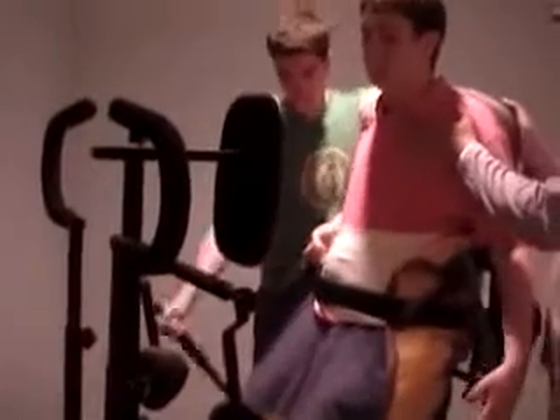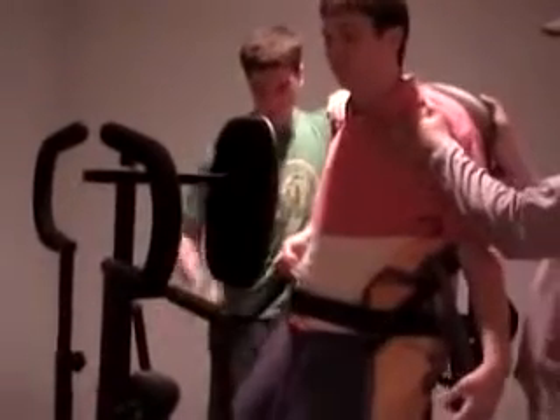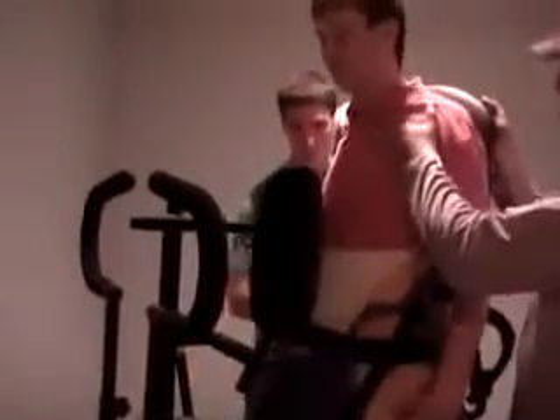Before standing, make sure all your straps are positioned correctly. Once ready to stand, have your caregiver place their hand on your chest and carefully be pumped into a standing position. It is important to remember that while being pumped up, a lot can happen — a spasm can occur, so make sure your caregiver keeps their hand on you the whole time.